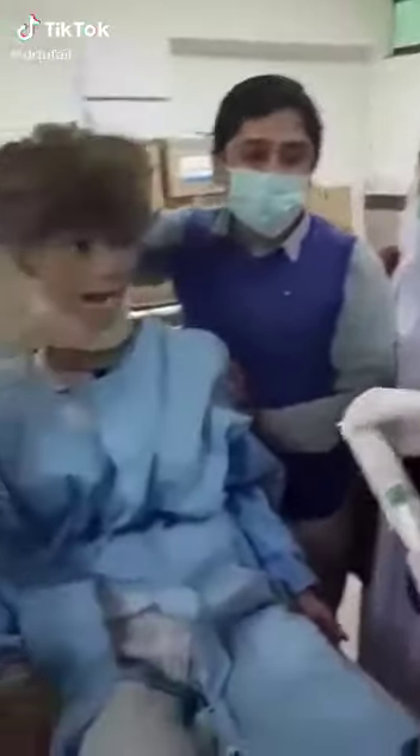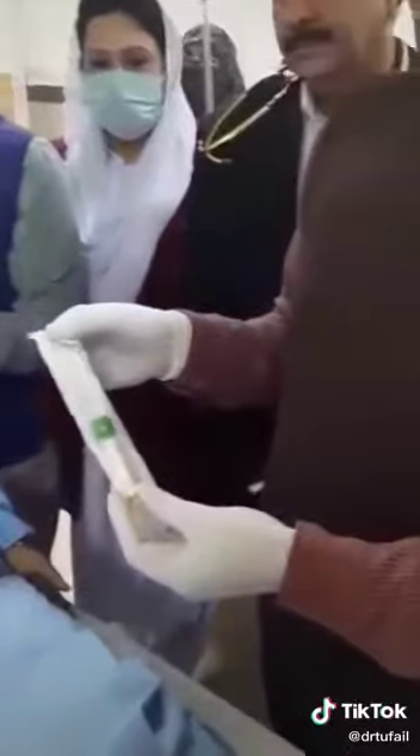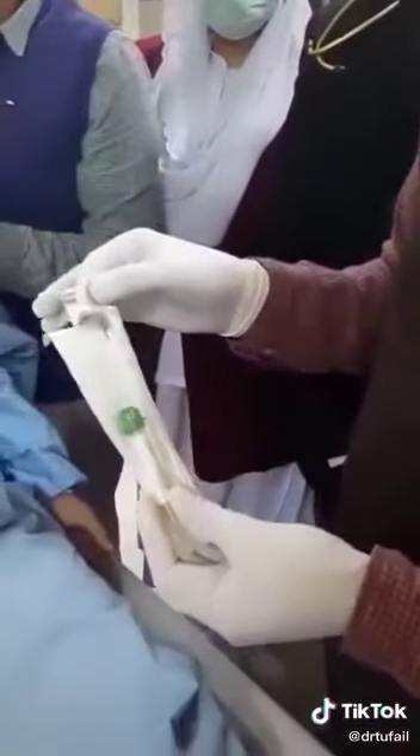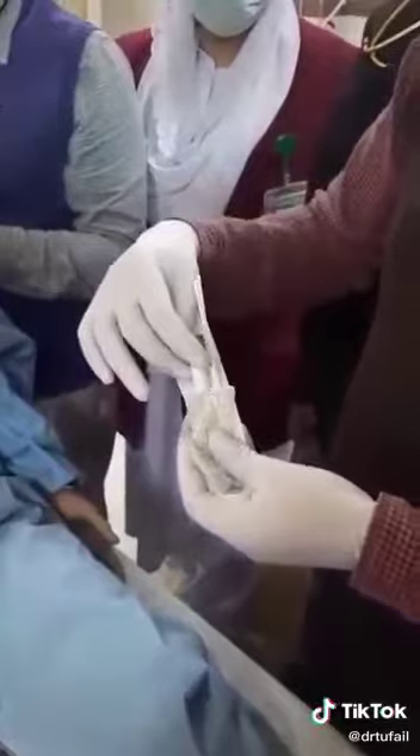Let's start. This is a specialized kit for the collection of samples for a suspected corona patient. This VTM contains a vial that is later to be used for the transport of two of the swabs in this kit.